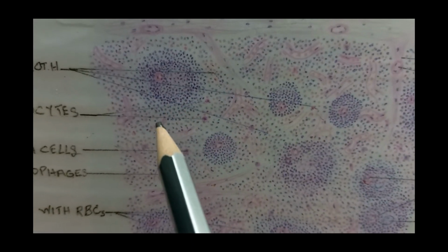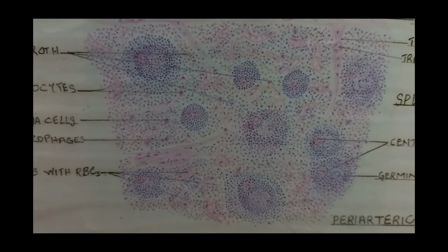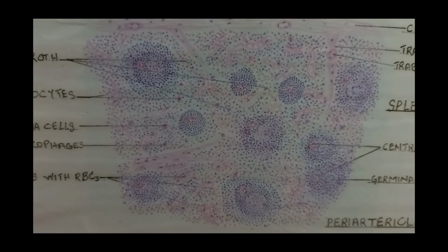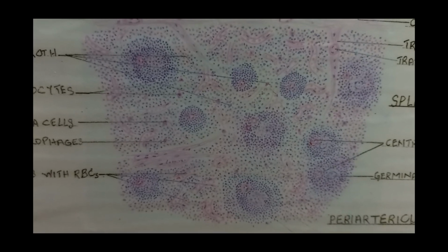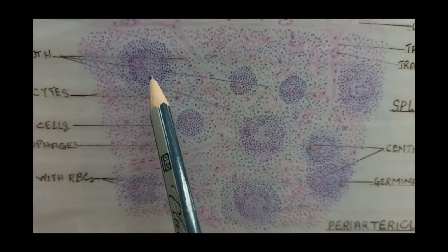So now we will discuss the white pulp. White pulp typically consists of lymphoid tissue. The lymphoid tissue is surrounded by the branches of the splenic artery and forms the periarterial lymphatic sheath. In the periarterial lymphatic sheath, you will find the T lymphocytes, and lymphoid nodules, which are mainly composed of B lymphocytes, and here you will find the secondary lymphoid nodules, mainly with the germinal center. As you can see here, the germinal center.